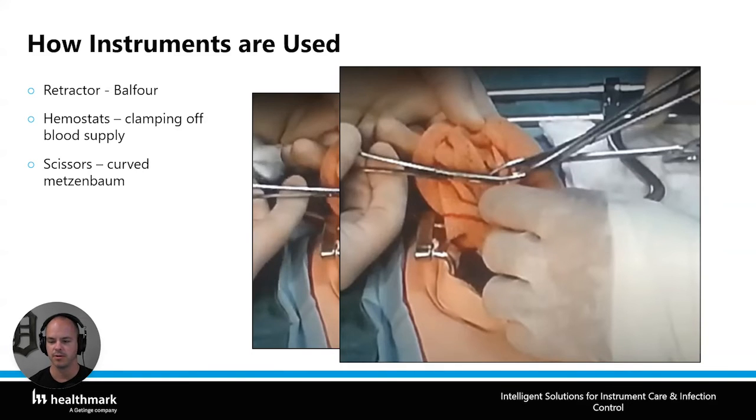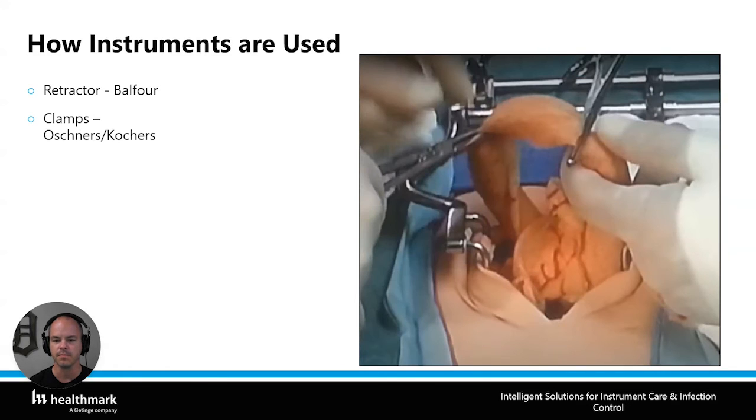All right. It's a little bit more delicate tissue. So now we got rid of the curved Mayo. We're going to use our Mets. And then after that, they're going to tie those off so that there's no bleeding. They'll do that with some suture. But that's the main part where, when you do a bowel resection, you have to take away the blood supply to that section and make sure that there's no bleeding when you remove that bowel.